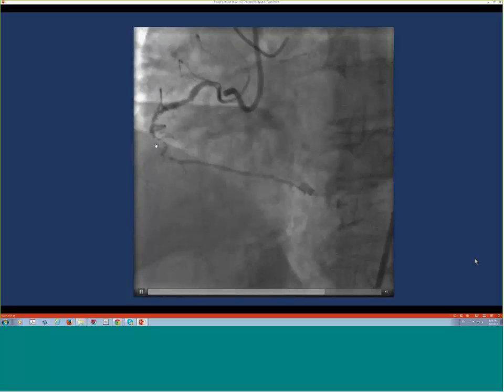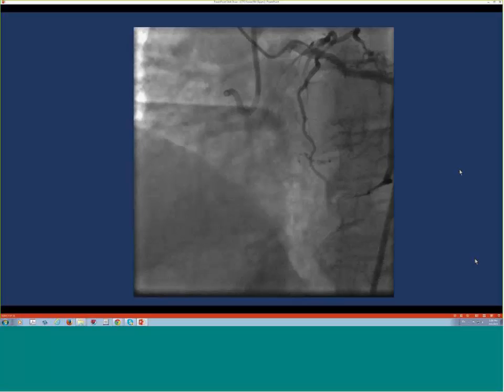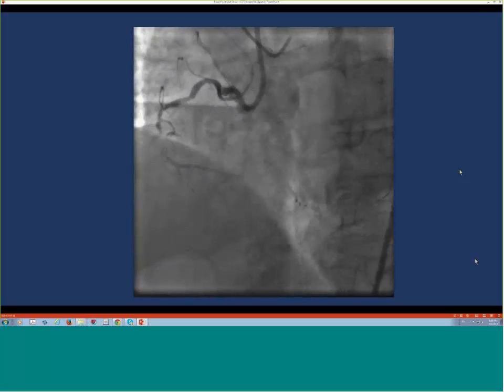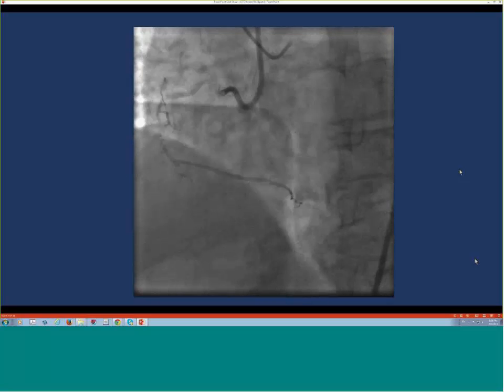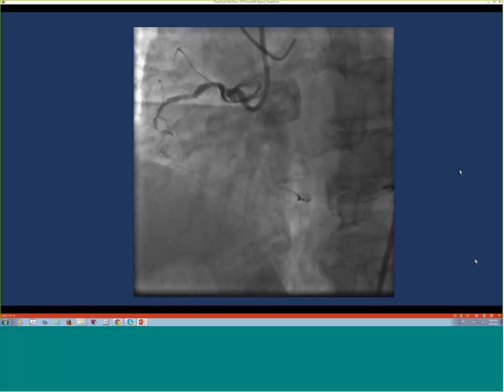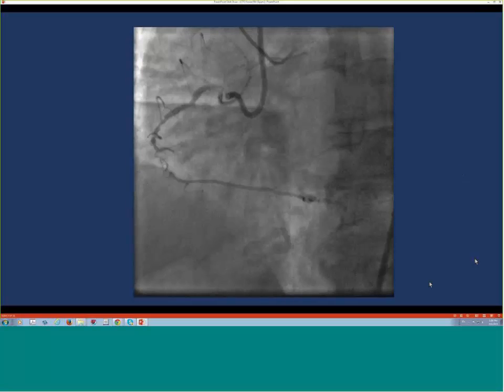and you'll see that the proximal cap is somewhat ambiguous. There's a branch that comes off of it right where the proximal cap is, and there's no beak that we could see. And so this was the concern we had, and we were thinking that if we were unable to puncture the cap where we thought it was, we would do the scratch and go technique. Okay? That's a great one, and I agree with you.